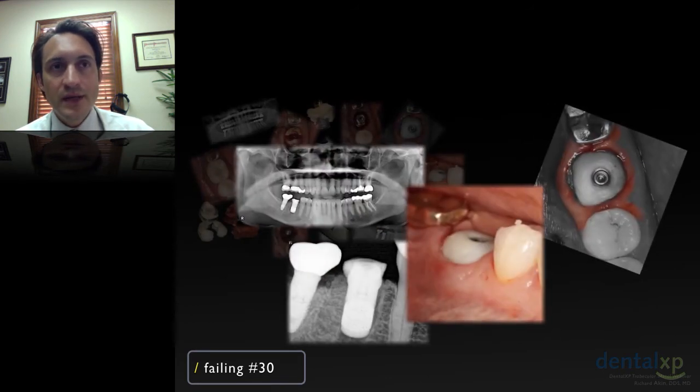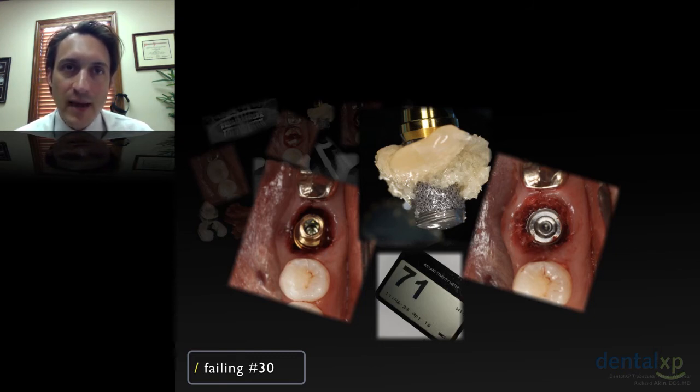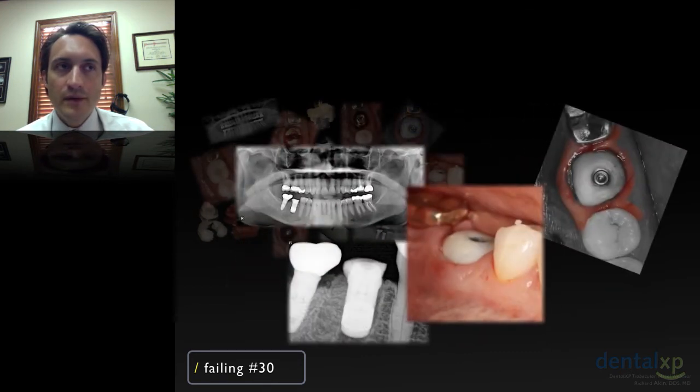What's done at this point is I will compact the bone circumferentially around the implant. I won't go supracrestal with the bone. I'll go to the crestal depth and then kind of slope it down to the level of the implant. And when I am fabricating the provisional, what I would consider the customized provisional abutment, you can see I like it to support the facial marginal bone. I want it to occlude the socket and use the same principles that I use in immediate provisionalization for these customization techniques in molar sites.